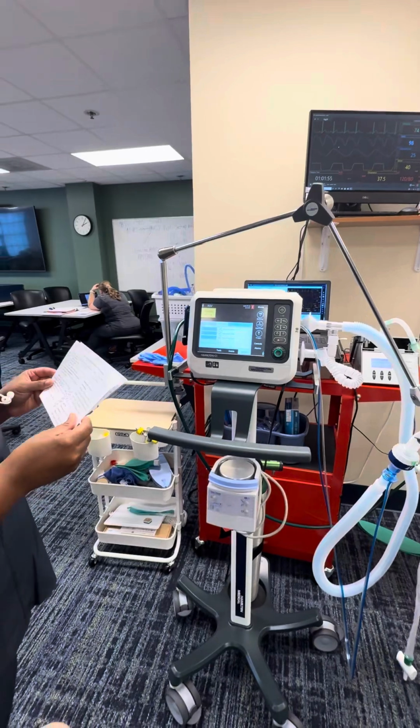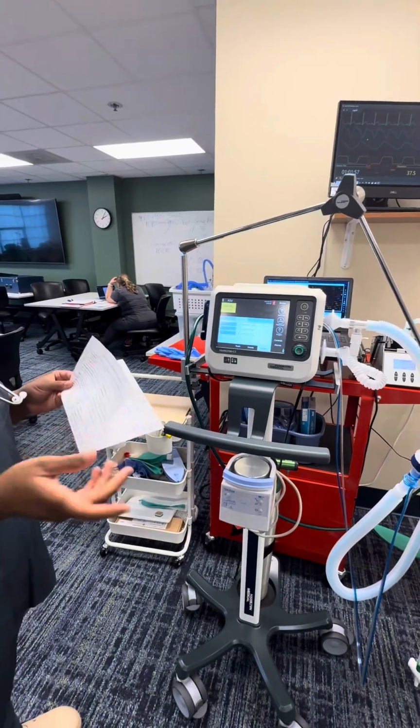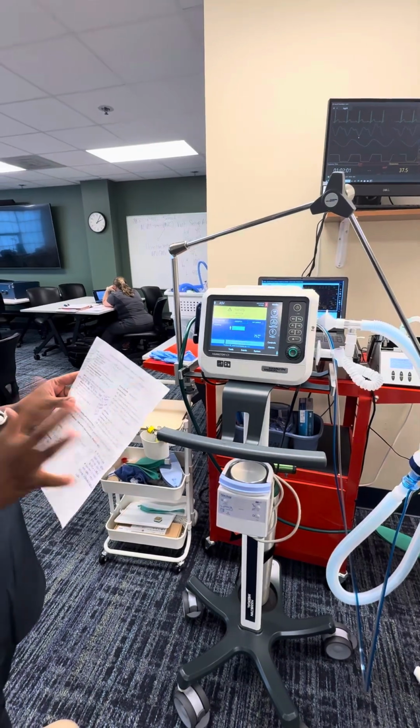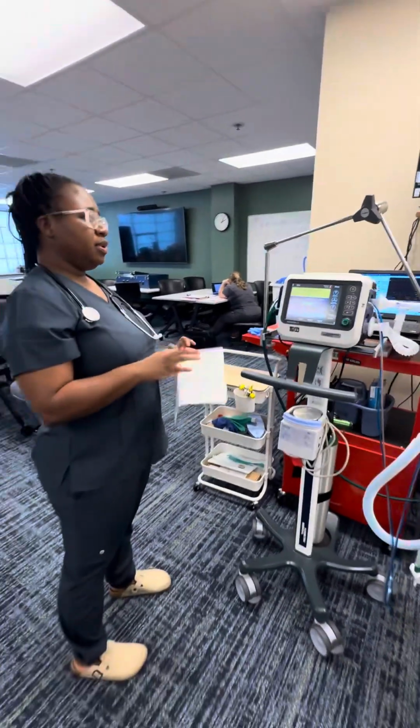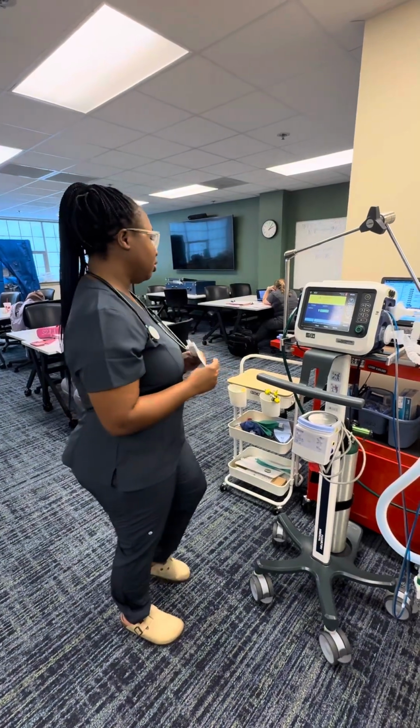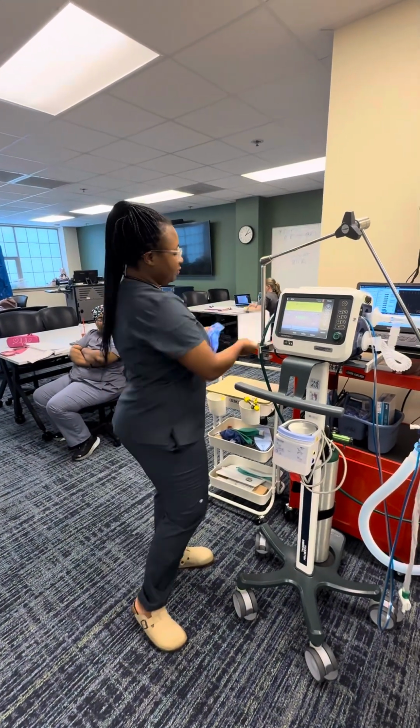This is a 60-year-old female with a history of COPD. The indication for this would be to improve ventilation and oxygenation. So I'm going to wash my hands and put on my gloves.